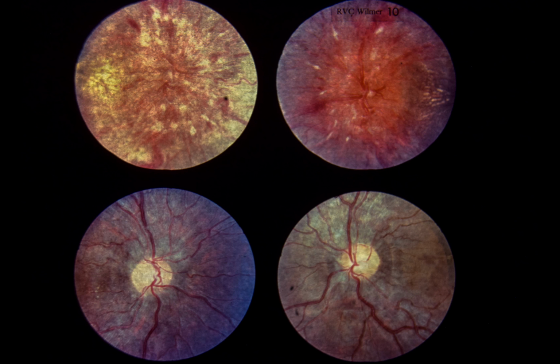Color vision was slightly diminished bilaterally, and pupils were normal. Visual fields were full peripherally with enlarged blind spots. Upper left and upper right. The optic discs are so hyperemic and edematous that no true disc is discernible. Numerous hemorrhages and cotton wool spots surround each disc, and a macular star figure is seen in each eye due to lipid accumulation in the outer plexiform layer of the retina.